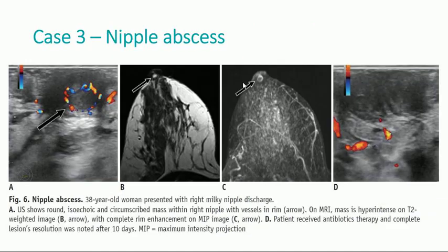Nipple abscess: patient presented with right milky nipple discharge. Ultrasound shows a round, isoechoic and circumscribed mass with vessels in rim. On MRI, the mass is hyper-intense on T2 with a complete rim enhancement on MIP image. The patient received antibiotics and complete lesion resolution was noted after 10 days.